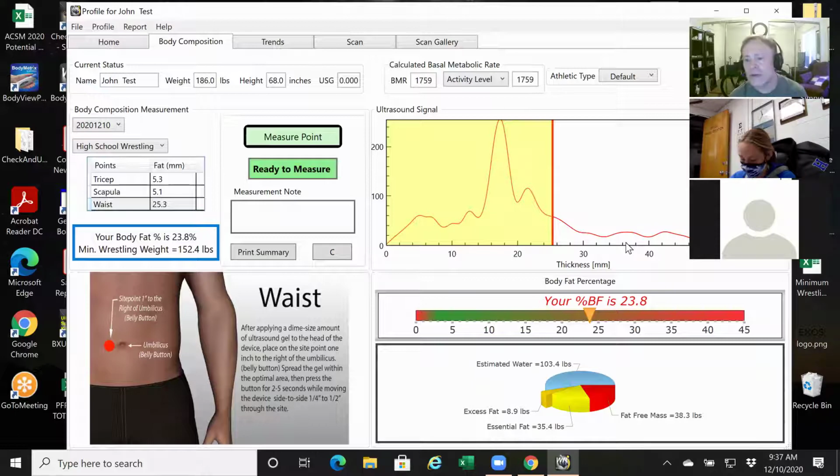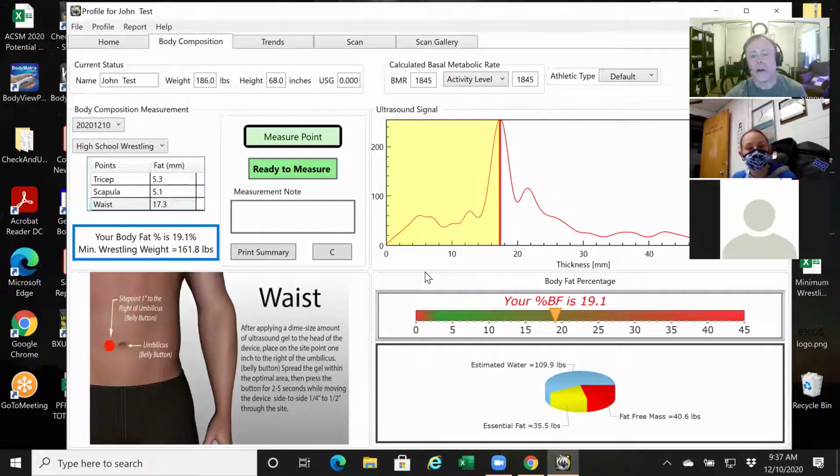Okay, so here's the outlying scenario. I'm going to go ahead and move this peak back. We'll adjust it back to where it should be. Okay. All right. So I had an assessor call me and he said, hey, I've got this gentleman. He's 5'11 and 360, big kid. And he was having difficulty even getting a measurement on him. It asked for like 5 different readings. It tops out at 5. He finally was able to get a reading.